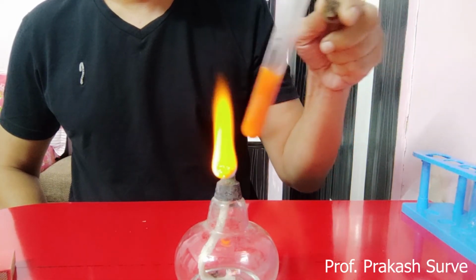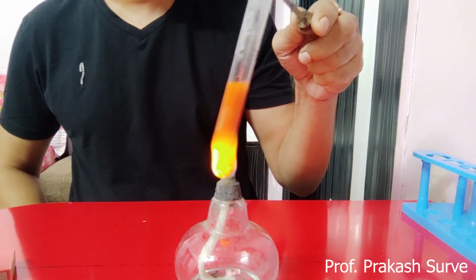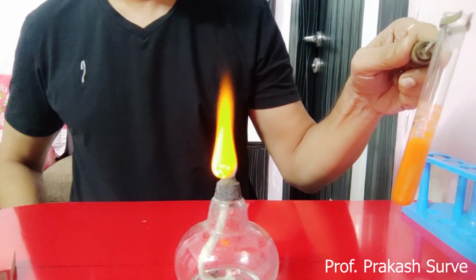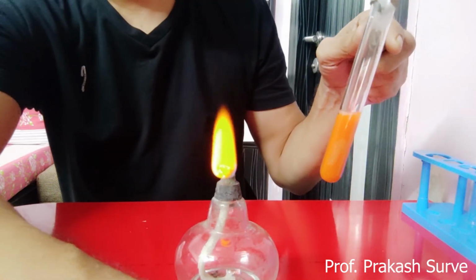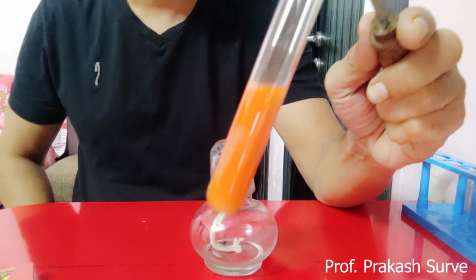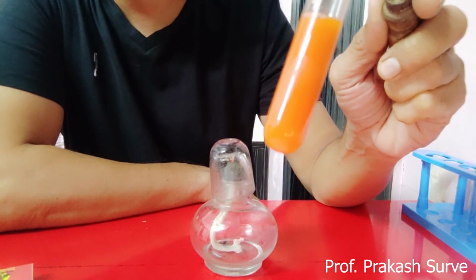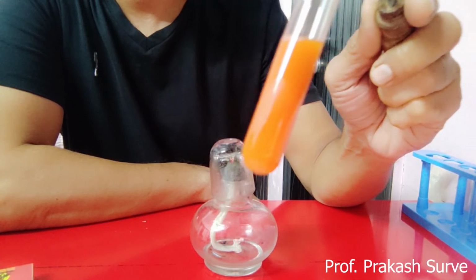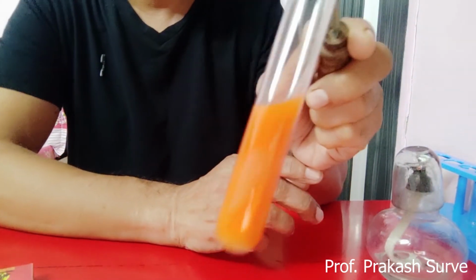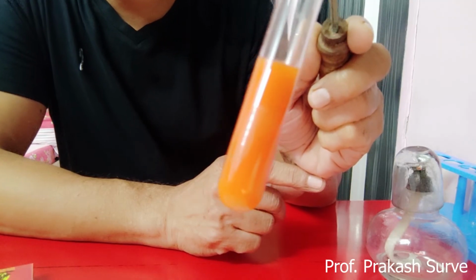precipitate is there. Okay, so you don't have to hold continuously, slowly you have to heat it, and then we get the result of brick red color. Now whatever the orange to brick red color precipitate is there in this urine sample, this indicates that it is the diabetic patient's urine sample. Okay, the person is suffering from diabetes. It means the glucose level in the blood is more.